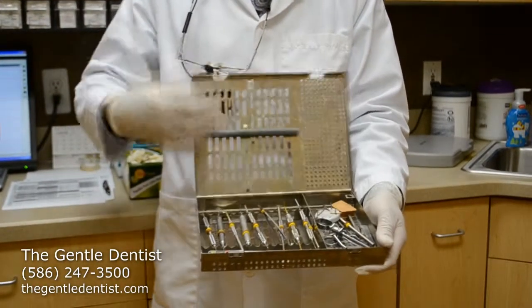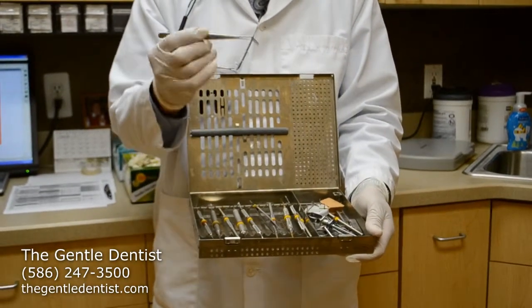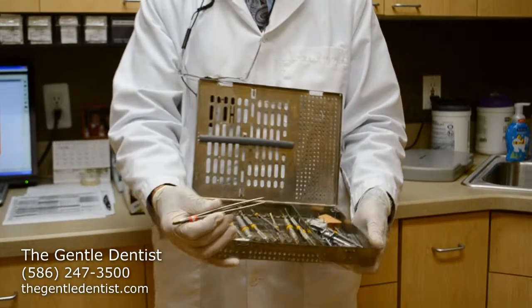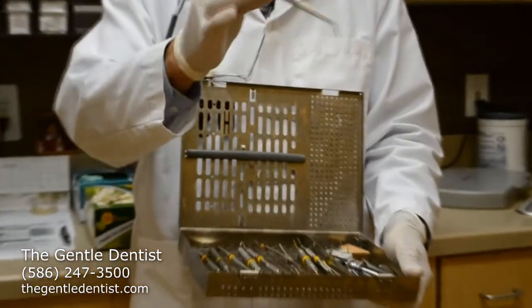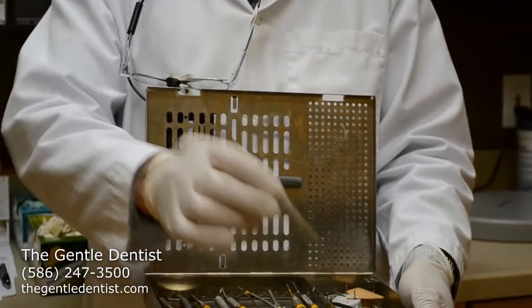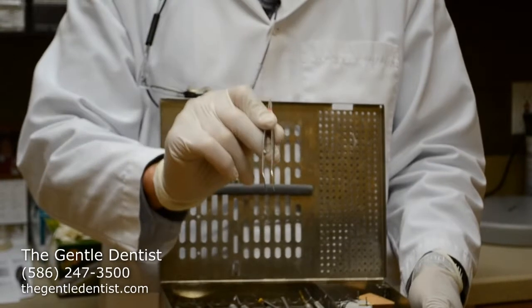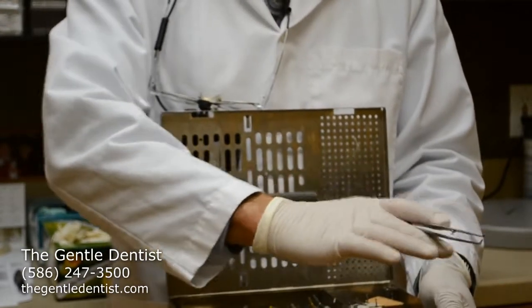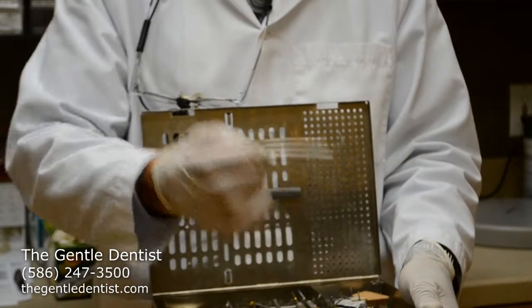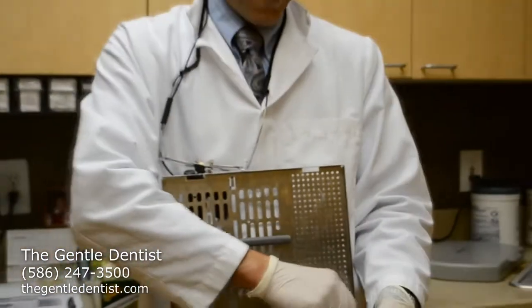One thing that we use is this item in red. If we're in the middle of a procedure and we want to grab something sterile from our drawers, we go into the drawer with this, we grab it with this, and we use it. We keep this only for that purpose, to make sure the rest of the drills or burrs don't get contaminated. We keep this set aside from the other things that we use.